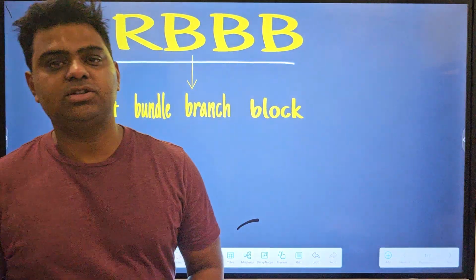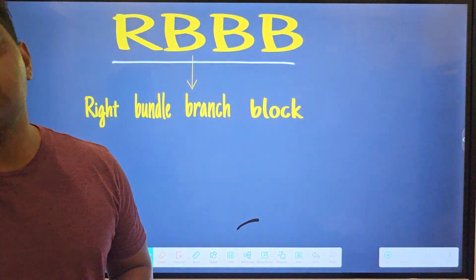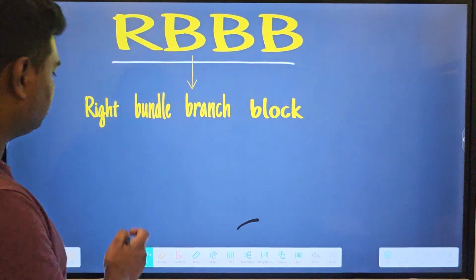So hello friends, today we'll start our next lecture on ECG. This will be the fourth lecture on right bundle branch block.